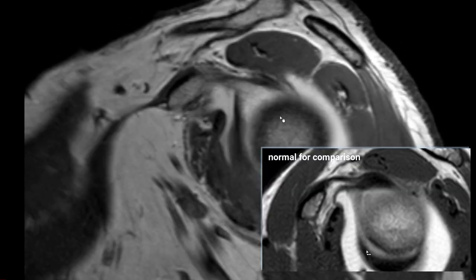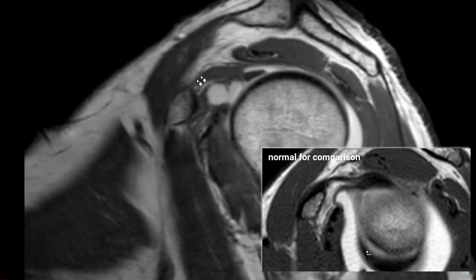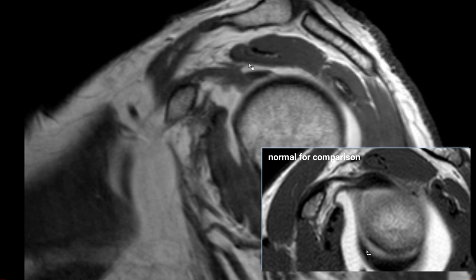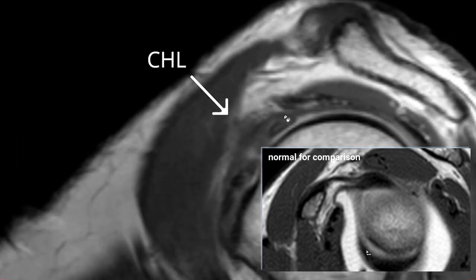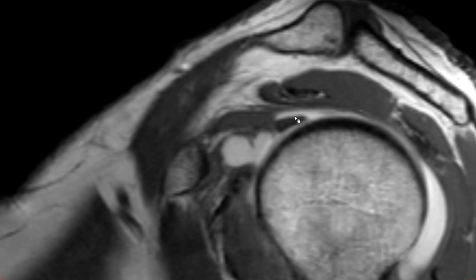Here is another patient — a 70-year-old male on PD fat-sat after IV gadolinium. The axillary recess is clearly thickened and not distended — already two good signs. On T1 without fat saturation, we see the rotator interval with some joint effusion, so it's not a complete obliteration as before. But the coracohumeral ligament, running from the coracoid process to its insertion, is clearly thickened — measuring approximately three to four millimeters — suggesting pathology and potentially consistent with frozen shoulder.